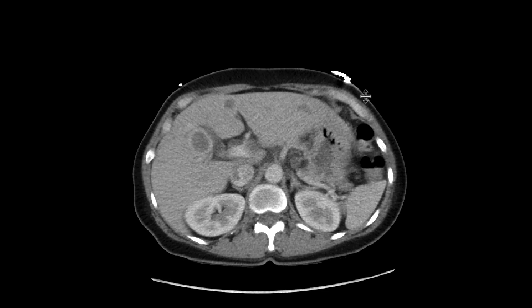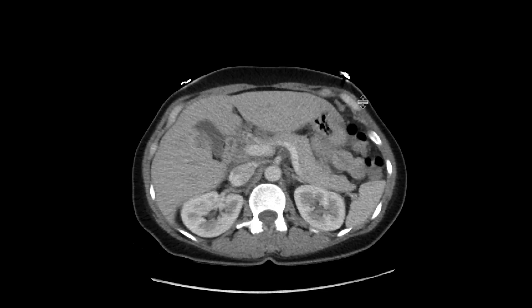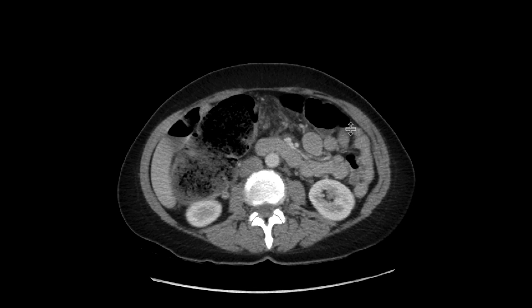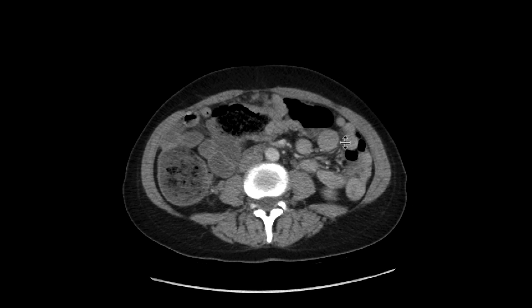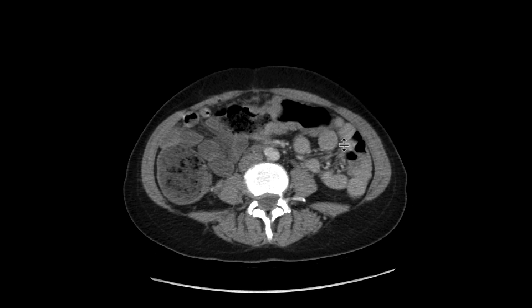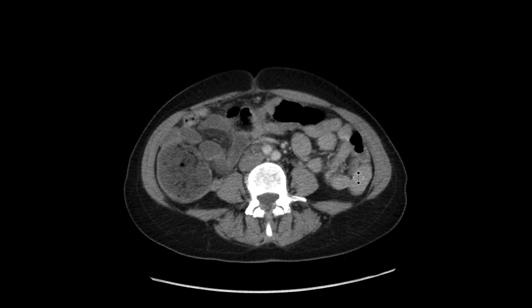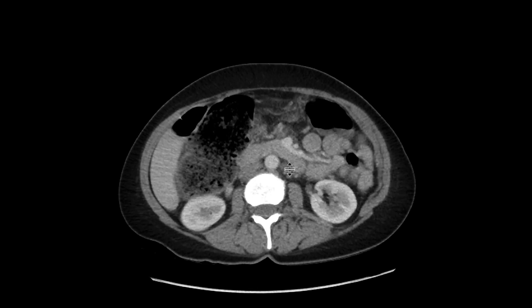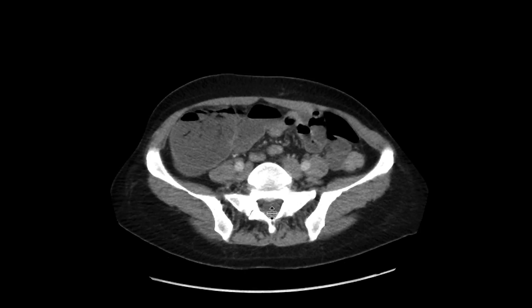As we look for the culprit resulting in this, we can see that there's an abnormality here involving the transverse colon. Look how thick this transverse colon is — there's soft tissue thickening, it's circumferential, it looks like an apple-core lesion, and the bowel that's upstream from it is quite distended.